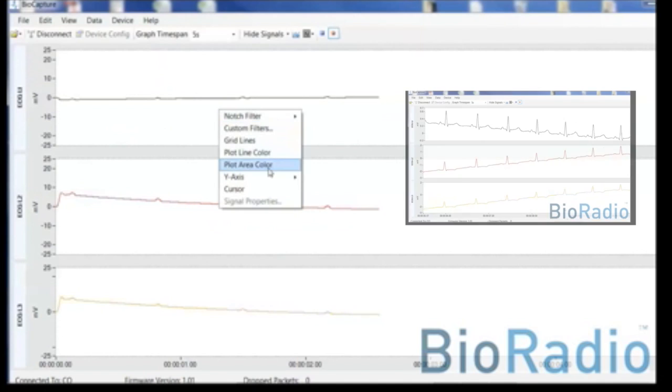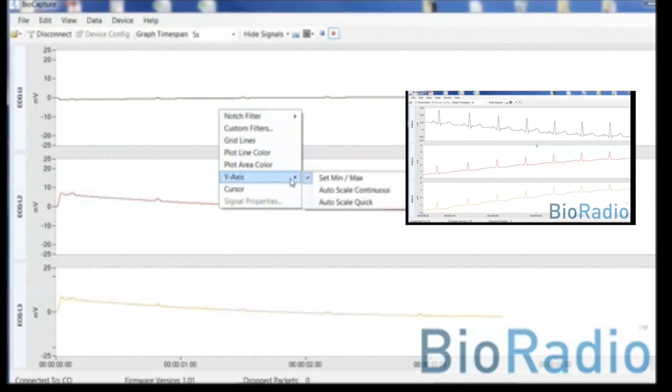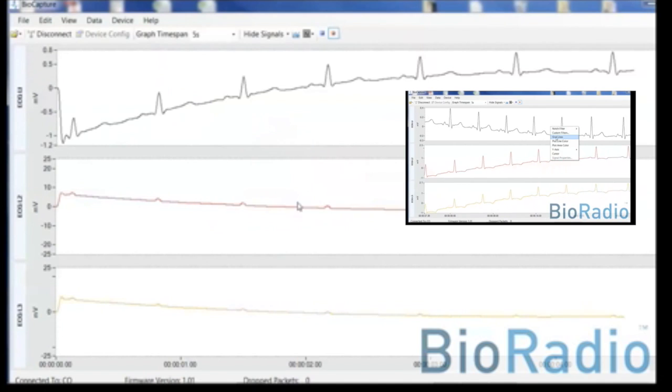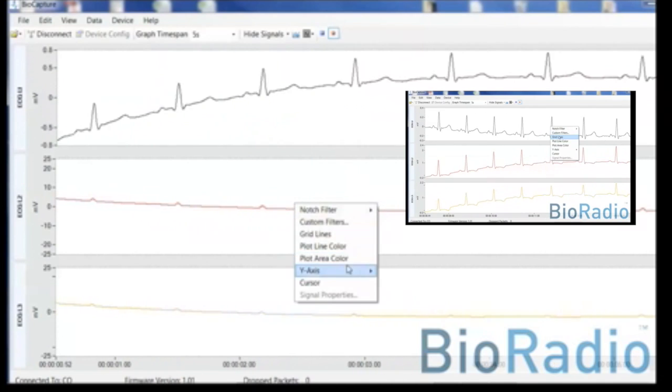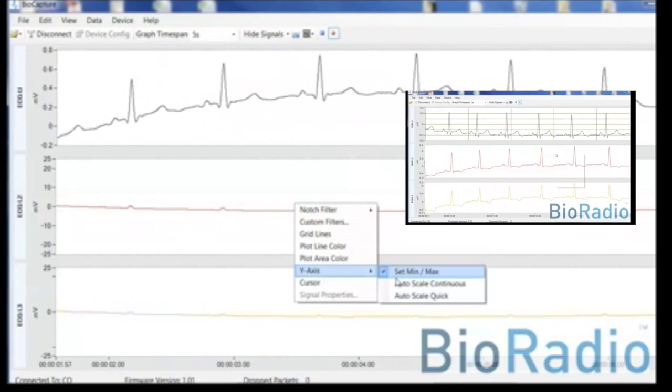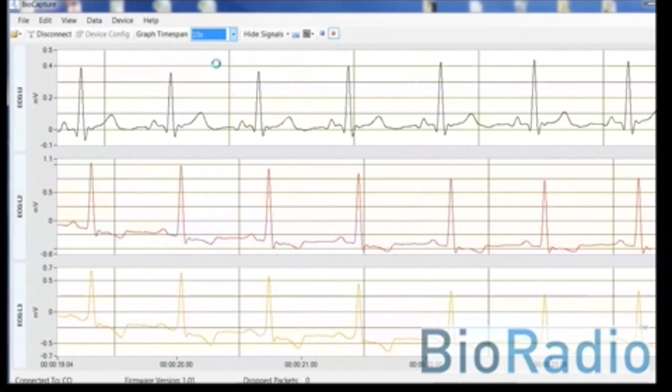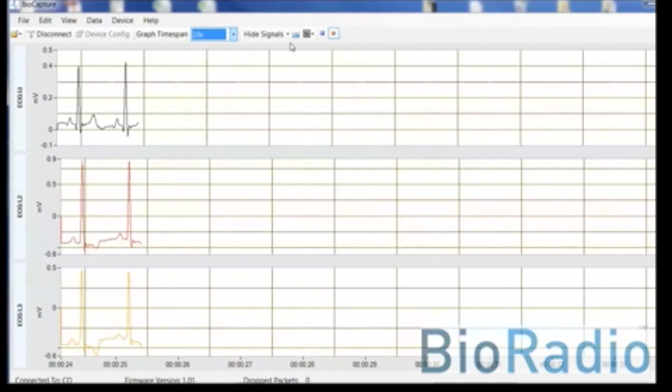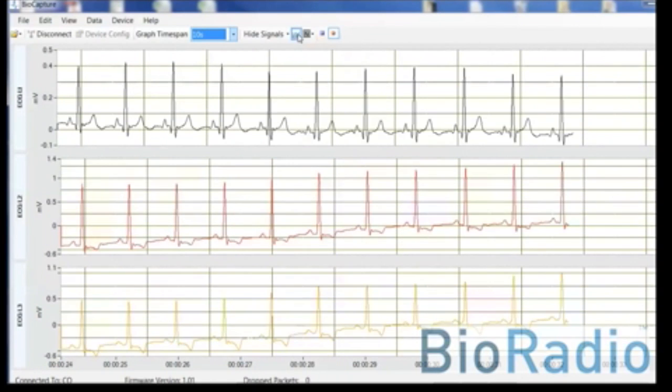As you're recording data, you can change your view settings, add grid lines for context, change your sampling rates, or apply a notch filter.